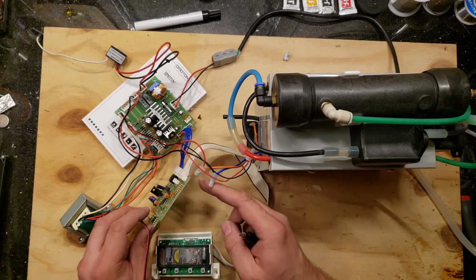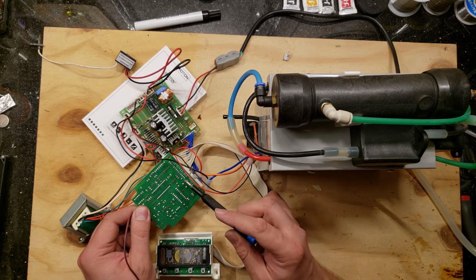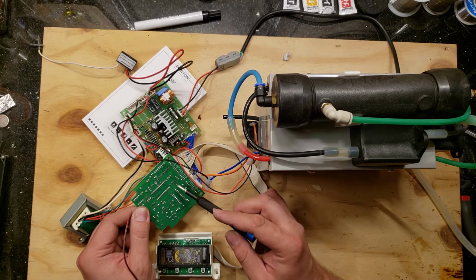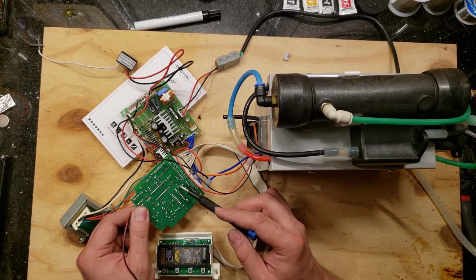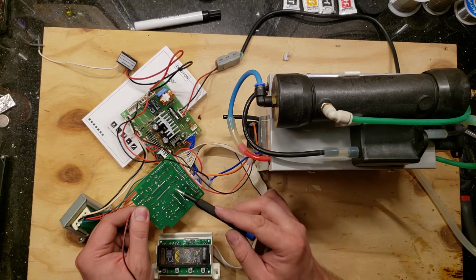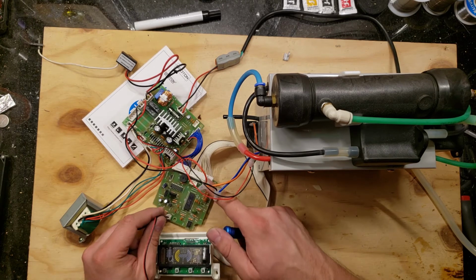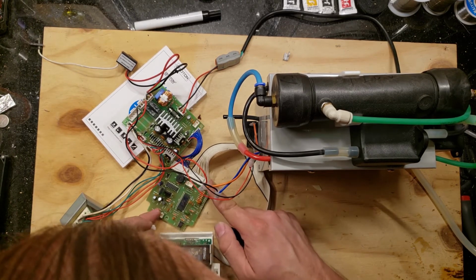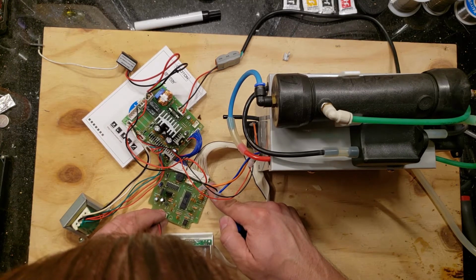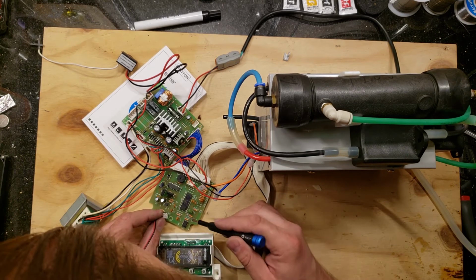Let's see if there's anything on this circuit board that would suggest. So there's an odd 3-pin connector here. It appears to have ground. It appears to have 2 other connectors going to the chip. I wonder what that does. It says CN11. Okay. Yeah, I don't really see. Oh, there's a resistor that's been clipped out.